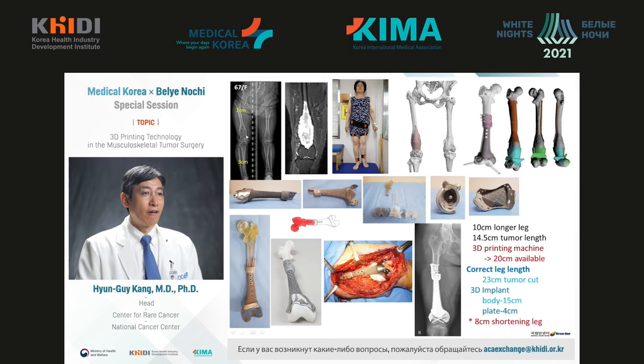Another patient, 67 years of age, had chondrosarcoma of her right distal femur. She wanted to save her knee joint, though in her young age she had a trauma of her left leg. Her right leg with the tumor was 10 centimeters longer. It was quite a complex case, but the result was successful. We diminished the length of her right leg by 8 centimeters.